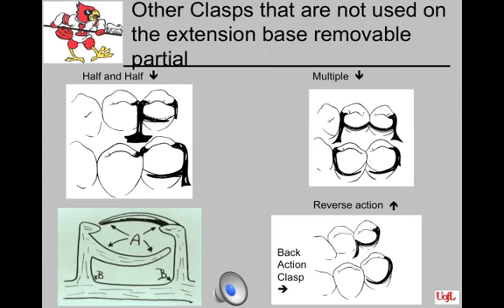Here are some other clasping mechanisms that you should understand, but they're not generally accepted as the ones we're going to use on an extension-base partial. We concentrate on a few clasping systems, but these may appear on a board examination for you.